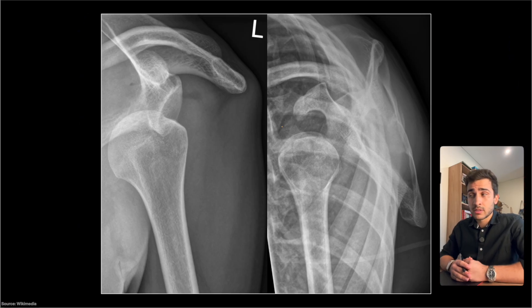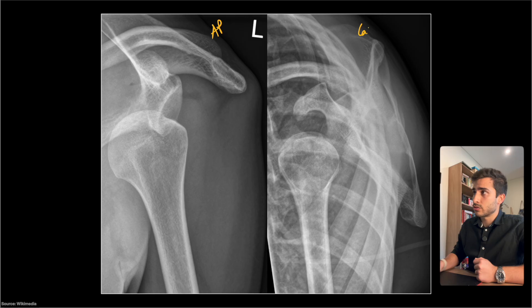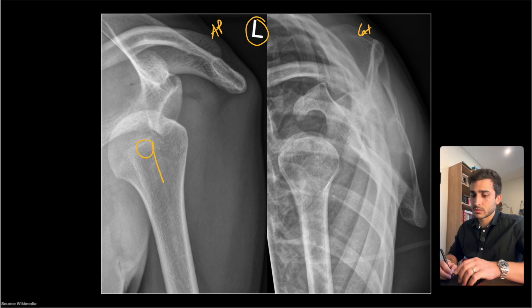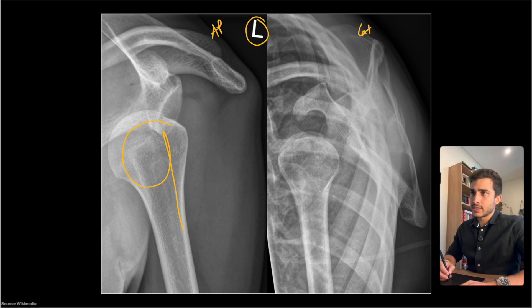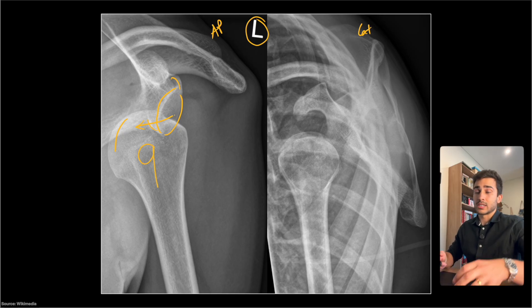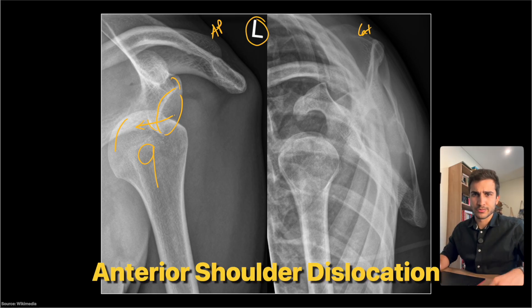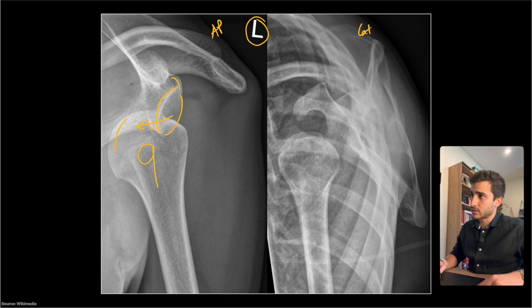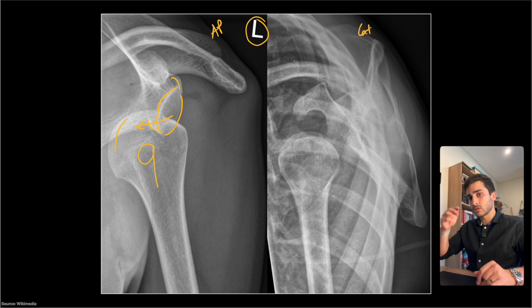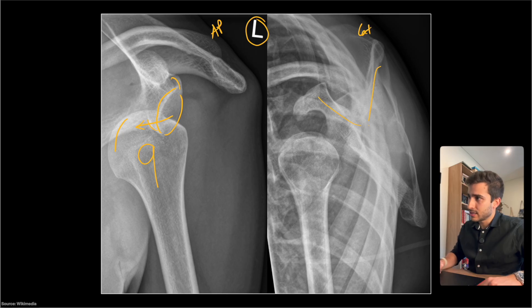Now for case two — we have an AP and a lateral of the left shoulder. Looking at the humeral head, it doesn't really look like a light bulb; it kind of looks like a Q. You can also see that it's dislodged from the glenoid fossa — this is the part of the scapula where the humeral head usually sits, but it's gone and dislodged. So very clearly, if it looks like a Q and it's dislodged, it's an anterior shoulder dislocation. The image on the right is an attempt at a Y lateral, which is ideally meant to look like a Y shape.